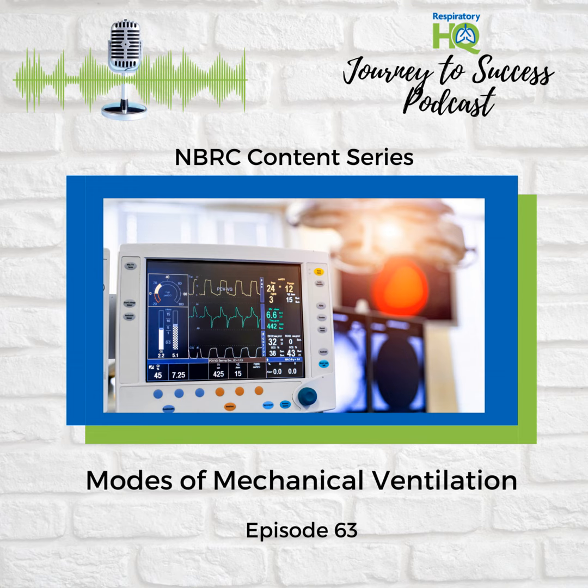So unlike some of the other modes we've talked about, CPAP isn't really about helping with the mechanics of breathing, but more about ensuring adequate oxygen levels. You've hit the nail on the head, and it can be an incredibly effective tool both in the hospital and for patients at home who need ongoing respiratory support. This is all so fascinating. We've covered so much ground, from trigger variables to breath stacking to pressure support, and now CPAP. I feel like I'm actually starting to understand how these ventilators work. That's great to hear. It's a complex field, but once you grasp the basic principles, it all starts to make sense. It really does. It feels like we've journeyed through the entire world of mechanical ventilation.